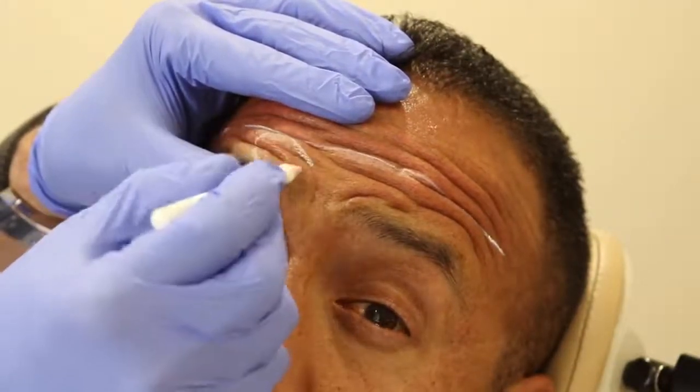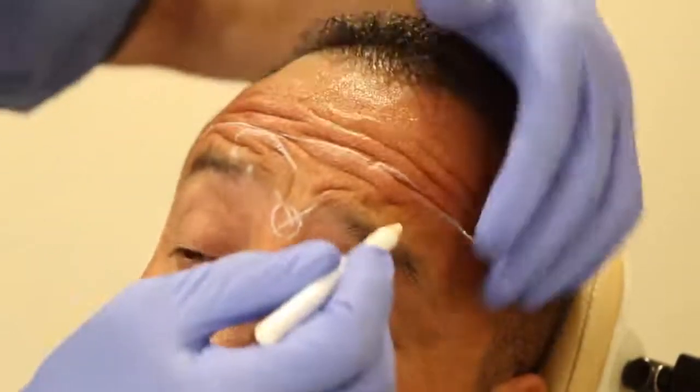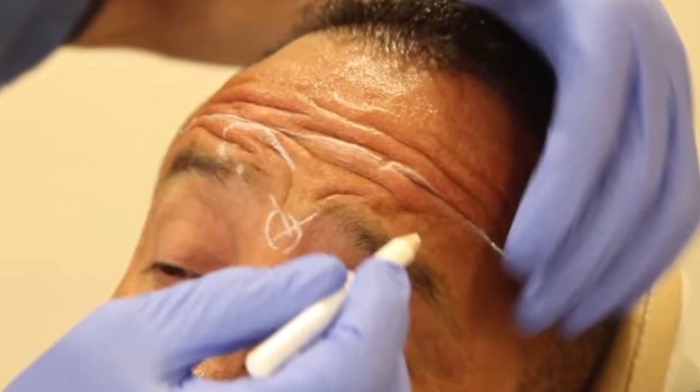Now, understanding the anatomy, I'm able to draw the superimposition of the corrugator muscle on the skin, along with the circle and the cross representing the procerus muscle in the midline. Again, take note of that little dimple marking the end of the corrugator muscle.